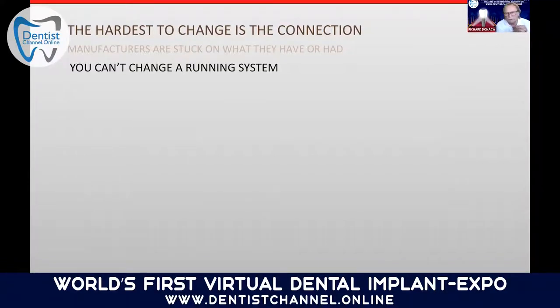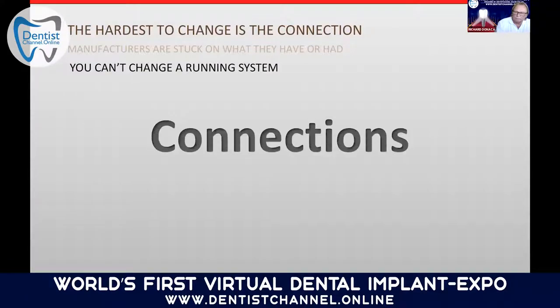The hardest thing to change for a manufacturer is the connection. Once you've started with the connection, it's very, very difficult to change, because then you change the whole system. You have all the new parts. They are not compatible. So manufacturers are kind of stuck on what they have, and they don't change a running system. We were fortunate, of course, to have the connection that we have stayed with also over the last 25 years.